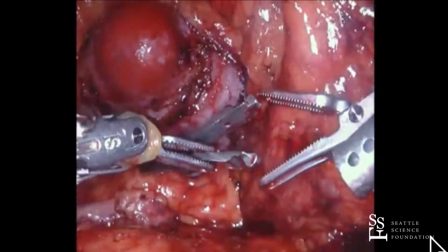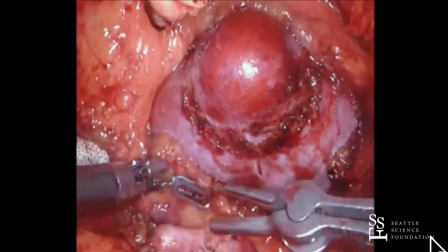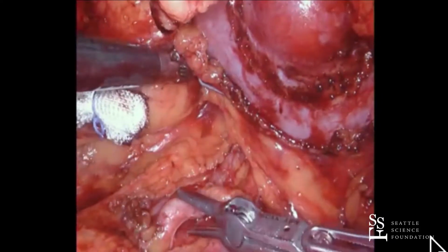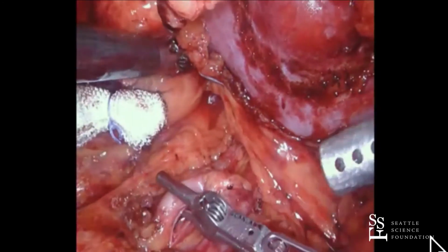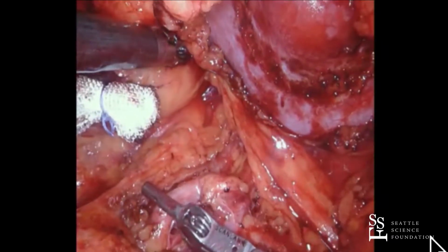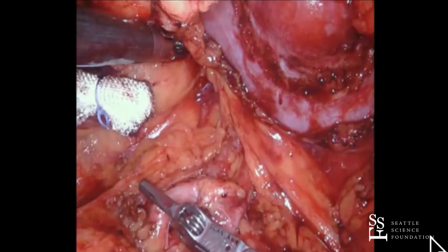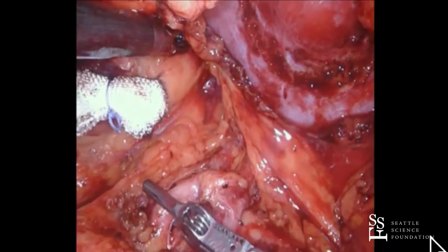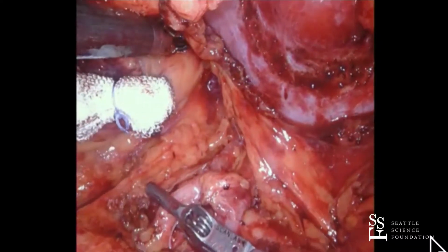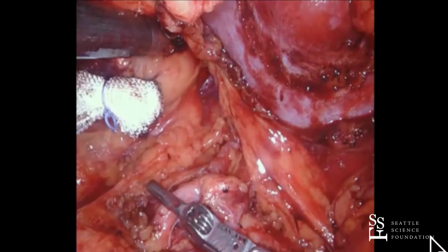Any questions before we go? Comments? Are you giving anything pre-ischemia, like mannitol or any other considerations? I heard Lasix. We don't have mannitol anymore. We were told by our nephrologist that it may have problems. The reason we're not giving ICG here is she has a contrast allergy, which we didn't know about until this morning. She got a CT scan with contrast, and all of a sudden we have a contrast allergy. So we're not going to give her the ICG. Is ICG contrast not a contraindication? It is. It's shellfish. No, it's a shellfish allergy. They say an IV dye allergy means you shouldn't use it. I've done it. ICG is iodine, so we can't give it to her. Anyway, it's always unclear.